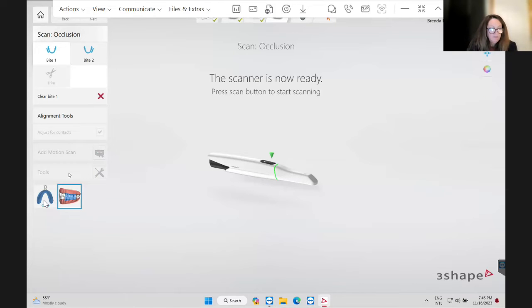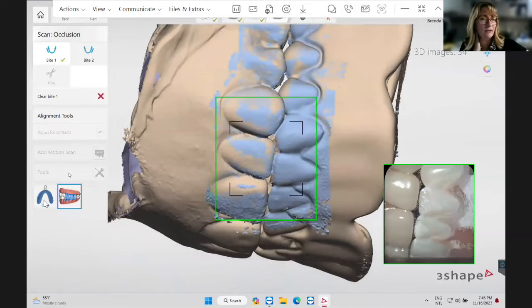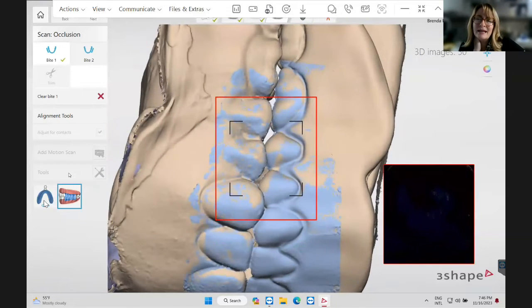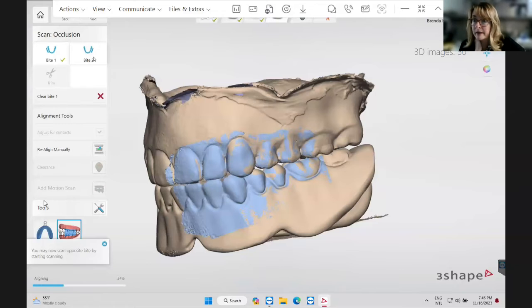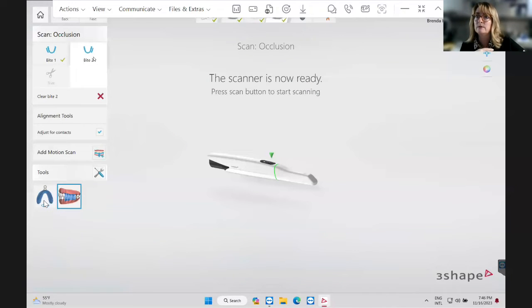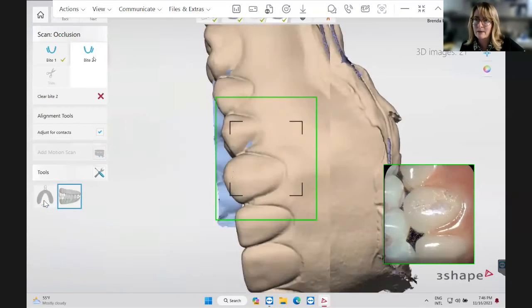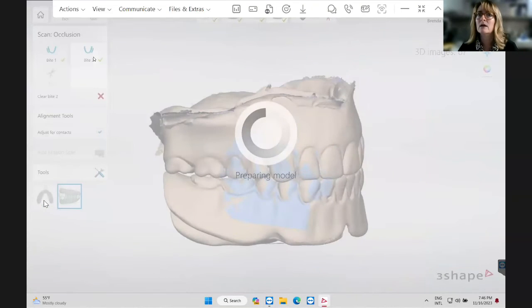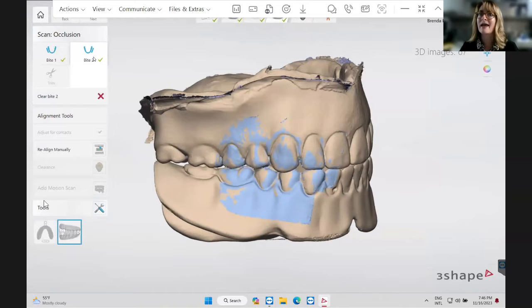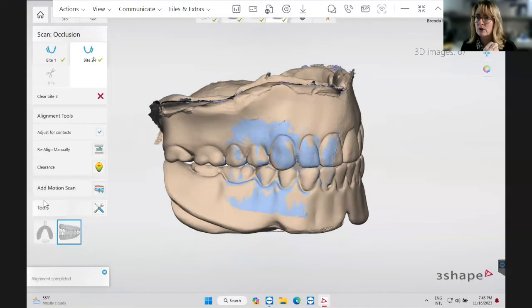How about you, Kelly? Same thing? Yeah, same. That's one of the reasons I like the reference denture. With an immediate, the nice thing is typically you're going to end up relining it. So you could very well capture a sufficient amount of data for the immediate denture, and then take that wash impression inside of the immediate for your final, once they're fully healed.